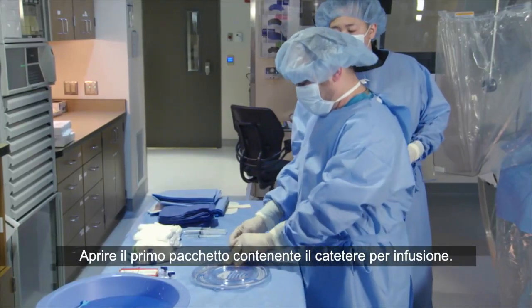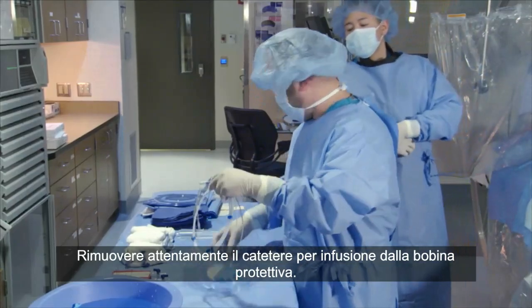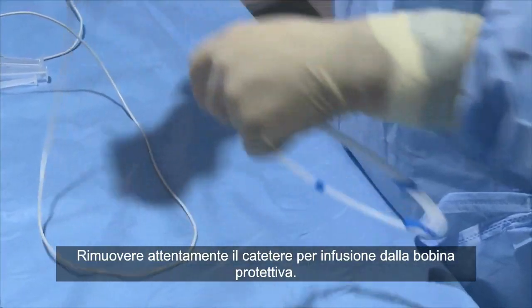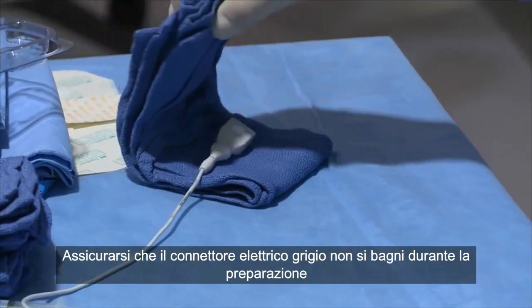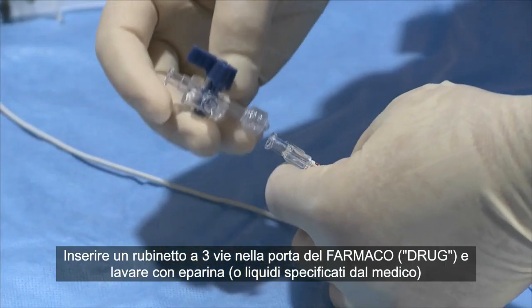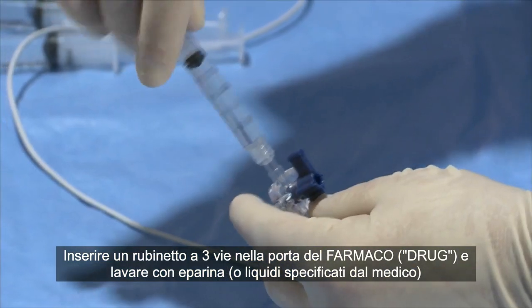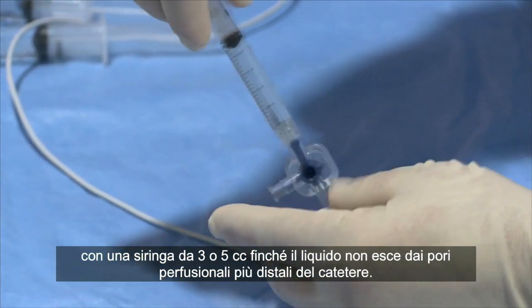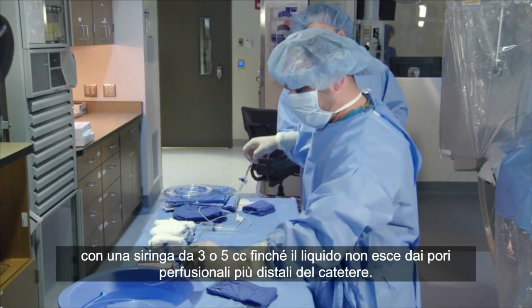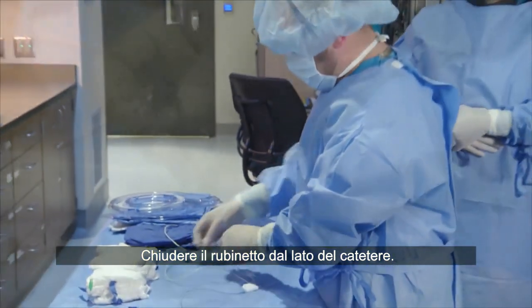Open the first package containing the infusion catheter. Carefully remove the infusion catheter from the protective coil. Ensure that the gray electrical connector does not get wet during preparation. Place a 3-way stopcock on the drug port and flush with heparin or physician-specified fluids using a 3 or 5 cc syringe until fluid exits the most distal catheter perfusion pores. Turn the stopcock off to the catheter.